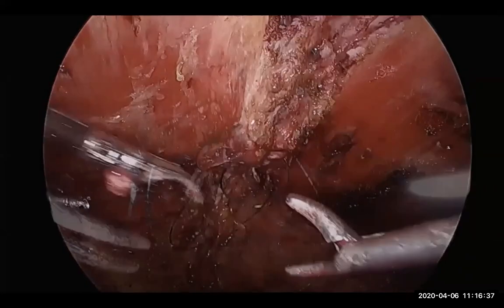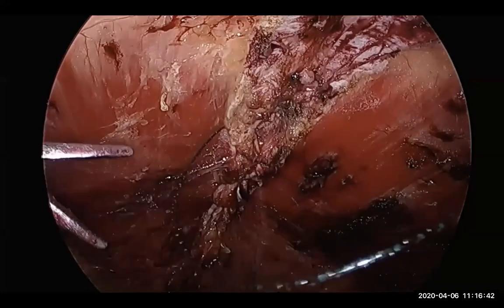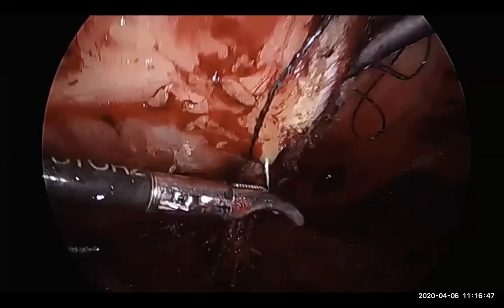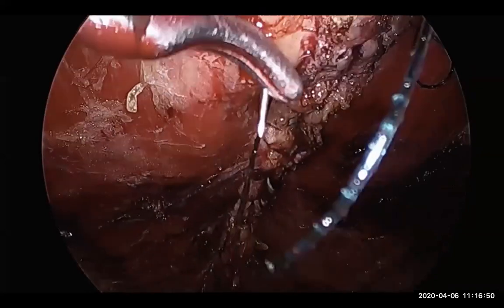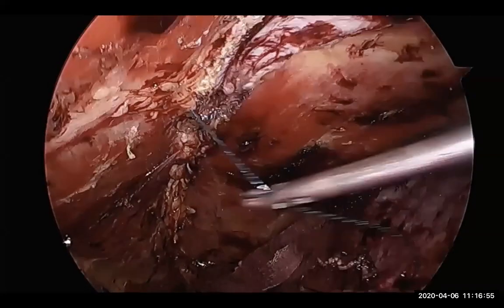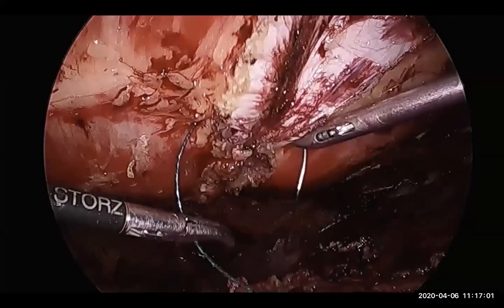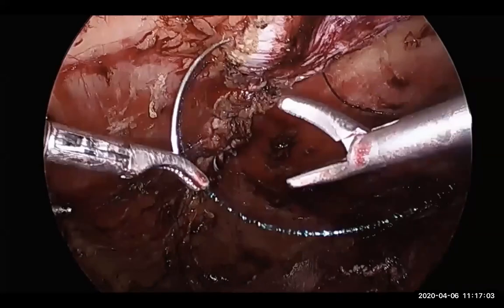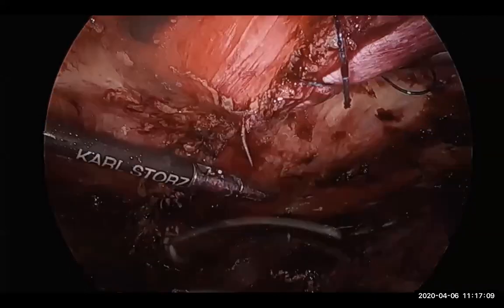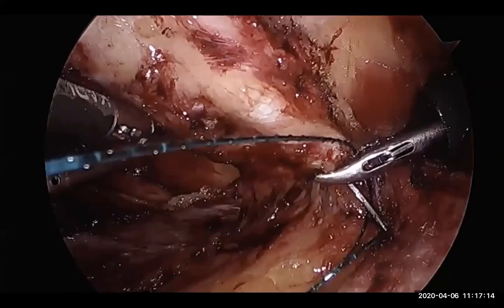And when the needle is lodged into the other side, you grab it once more with a perfect alignment. So it becomes a very quick and elegant way of changing the bites, going from the first bite to the next bite, and it saves a lot of time. If the needle keeps moving here and there, then it becomes clumsy and tedious to do the operation. So if you see this, the bite is precise every time and don't go into the muscle, okay? You prevent taking a bite through muscle that will lead to bleeding.